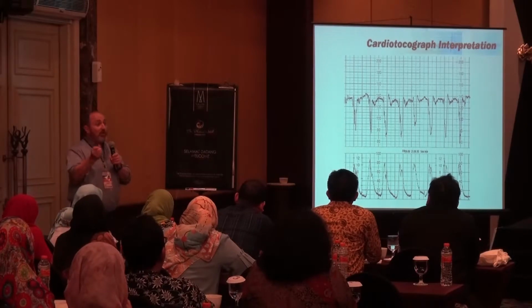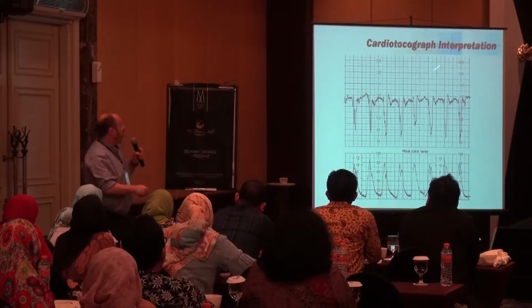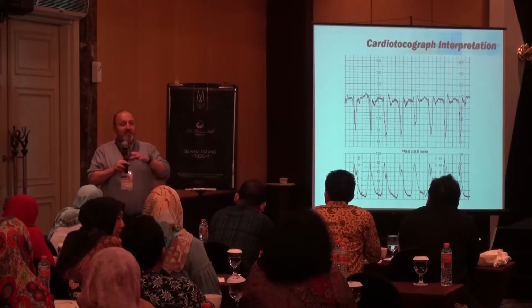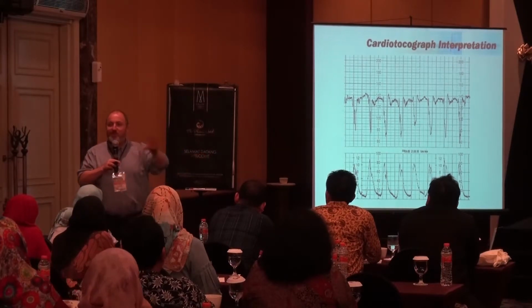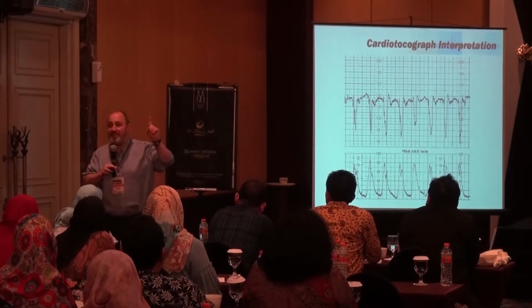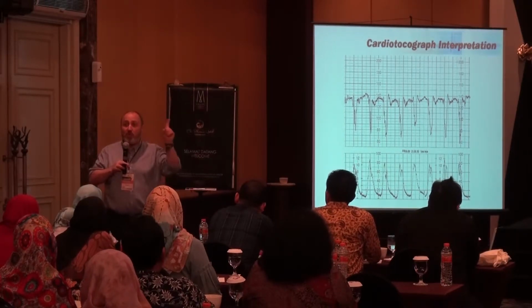Shouldering. So there's overshoot on recovery, isn't there? Not with every one of them, but as a pattern overall, most of them are showing overshoot. People will often say to me, Declan, but this one deceleration here, we don't care about one deceleration. If I showed you a pattern of early decelerations and there's one late, the overall pattern is early, and you're not going to be concerned about that one late.